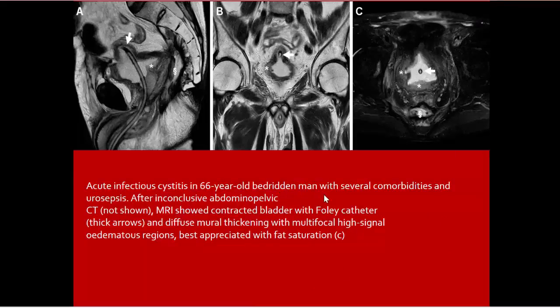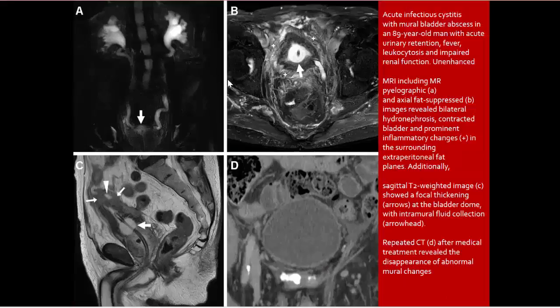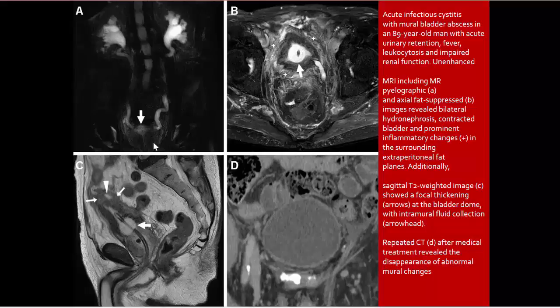Active infectious cystitis in a man with several microbes, urosepsis. Contracted bladder with Foley catheter, diffuse mural thickening, multifocal high signal thickening, edematous region best appreciated on fat saturation. Mural bladder abscess on MRI with fat-suppressed sequences shows bilateral hydronephrosis, contracted bladder, prominent inflammatory changes surrounding extravesical fat. Additional sagittal T2 shows focal thickening, intramural fluid collections. Medical treatment resolves the appearance of abnormal mural changes.